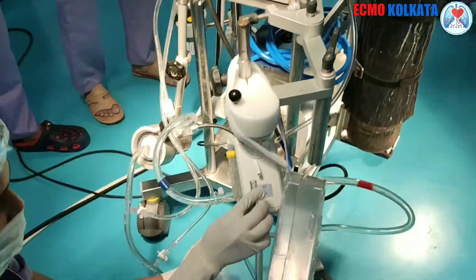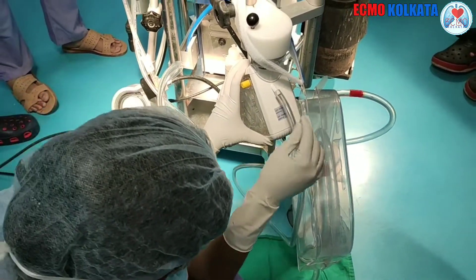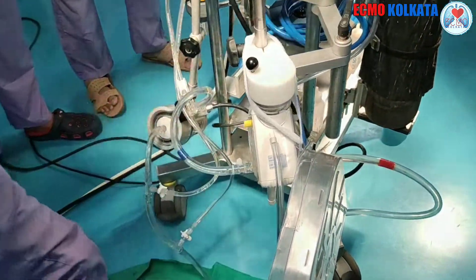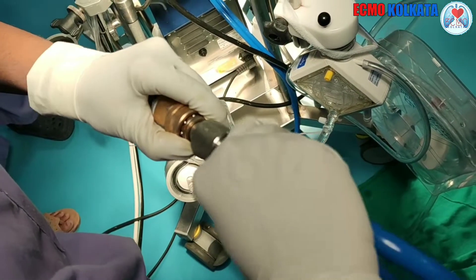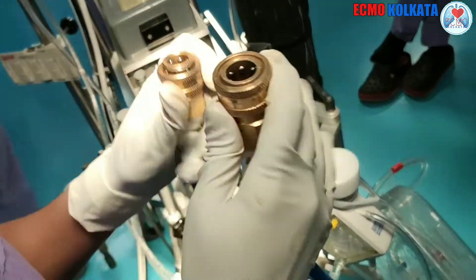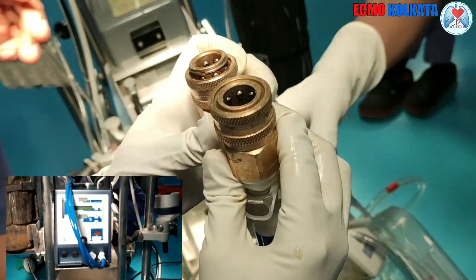Now is the time to connect the gas port with the oxygen tube from the blender. To maintain the blood temperature, the oxygenator is connected with the hemotherm. Connecting the hemotherm is done carefully, and at that time the hemotherm remains off.